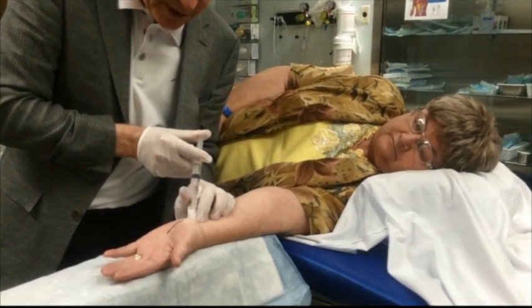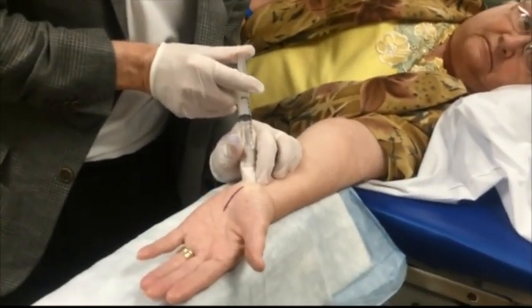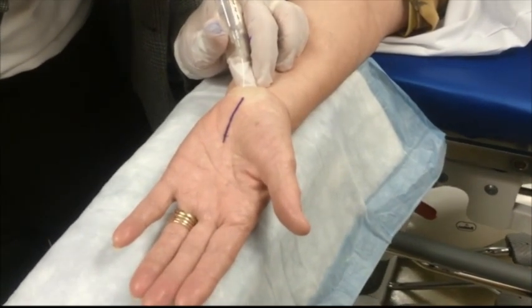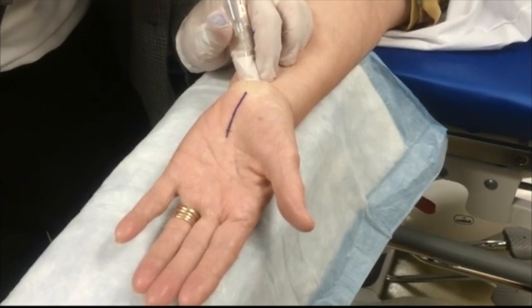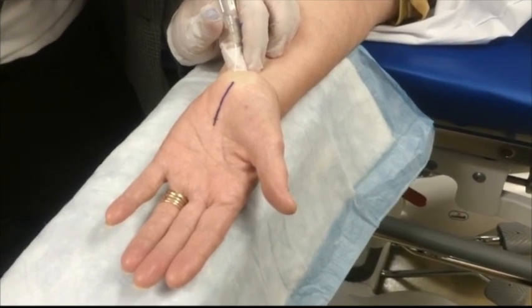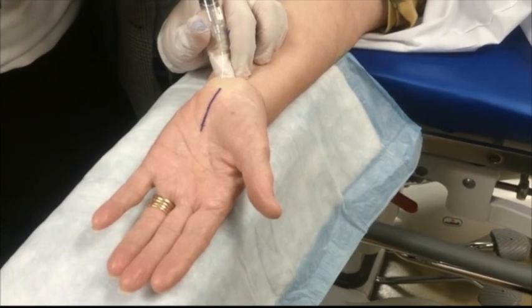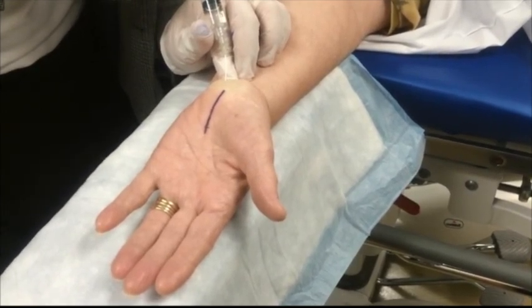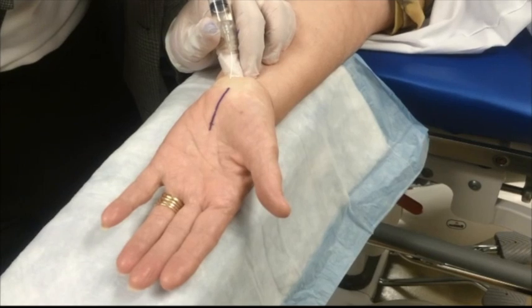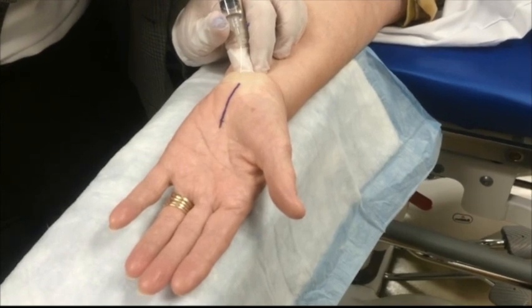Dolores, can you come closer and show the hand from above so they can see the large goose egg being put there — it's all white. It's probably more local than you need. I've never had a patient complain about being too numb, but I've had lots complain about not being numb enough. Now I'm slowly advancing my needle to make sure it gets underneath the superficial forearm fascia, which creates a natural barrier to diffusion of local anesthesia.